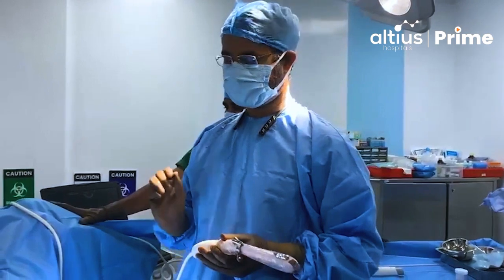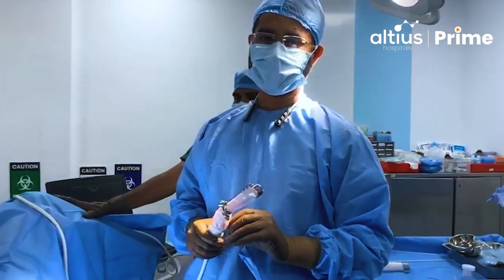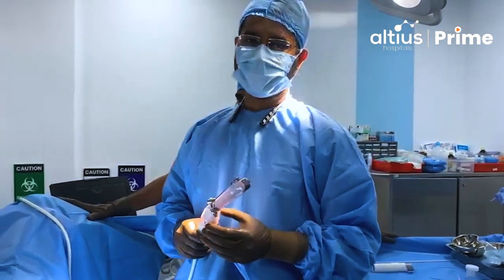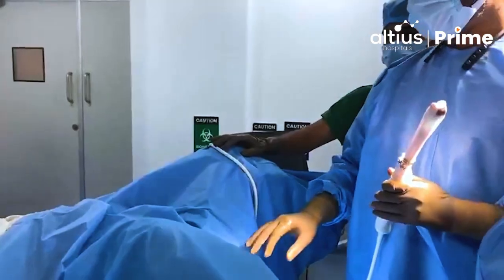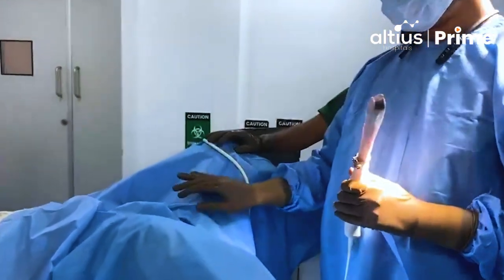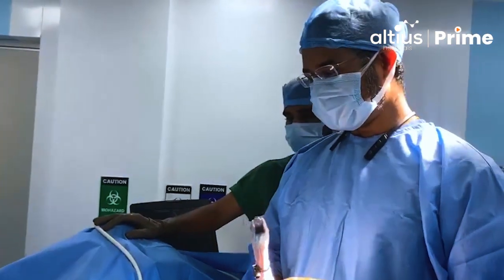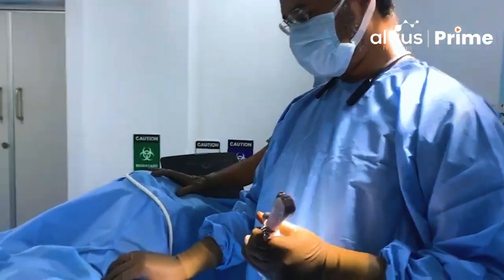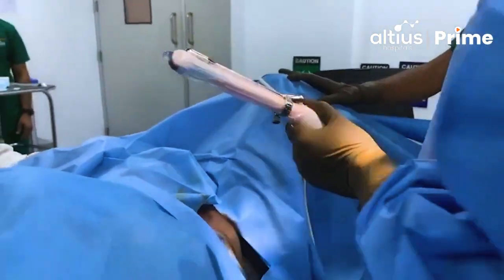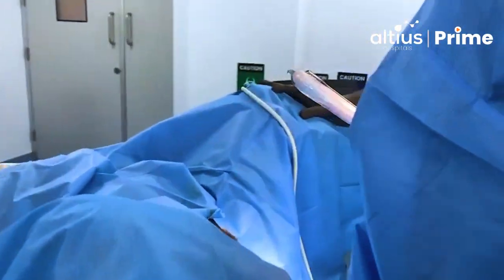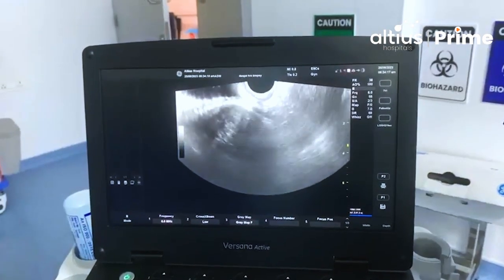This is a minimally invasive procedure for obtaining a sample from the target lesion, which can be utilized for histopathological analysis, and accordingly the treatment management can be decided. The patient is to be put in lithotomy position, sterile precautions must be taken, the perineal area is to be draped well and cleaned with povidone-iodine.